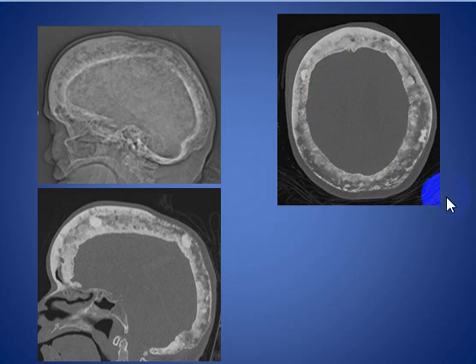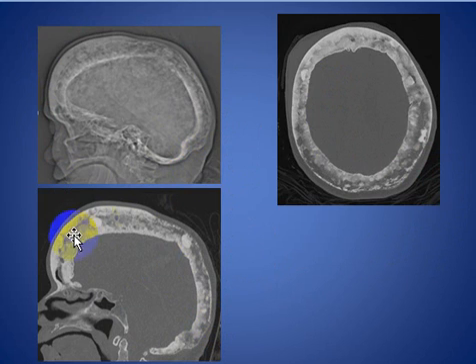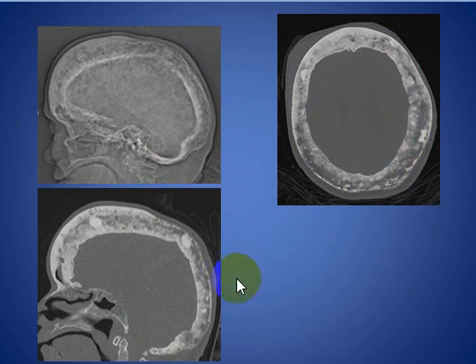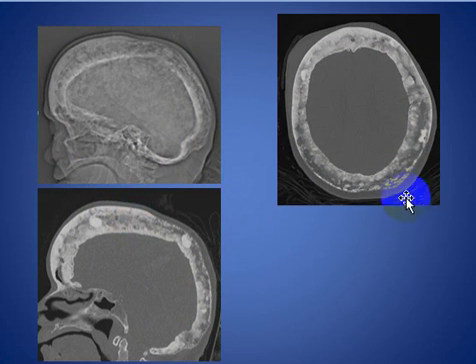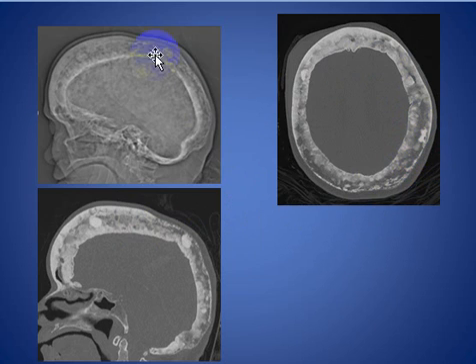This patient has Paget's disease with diffuse skull vault thickening. You can see the sclerotic appearance with widening of the diploic spaces and also the classic cotton wool appearance seen in diffuse skull vault thickening. This is classic Paget's disease.